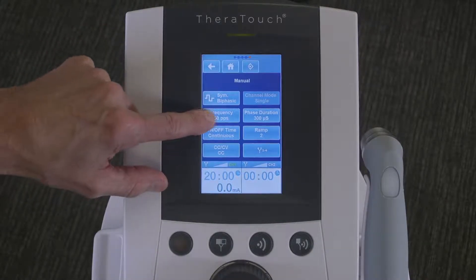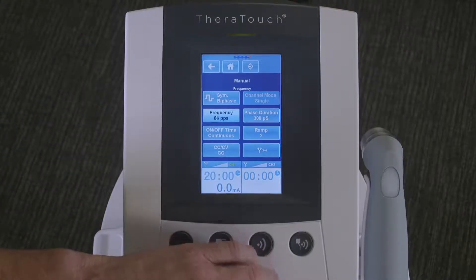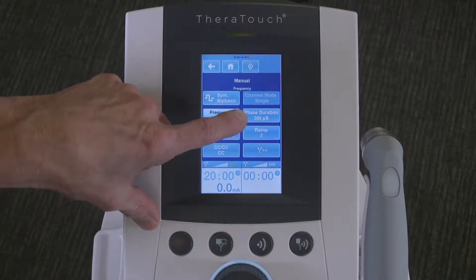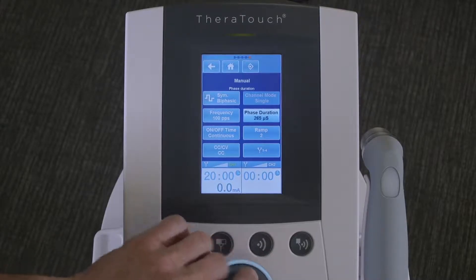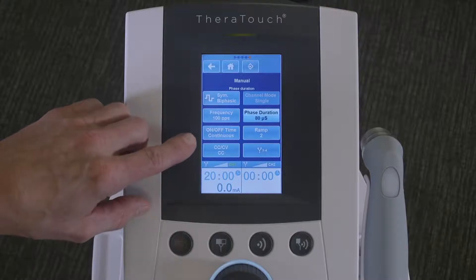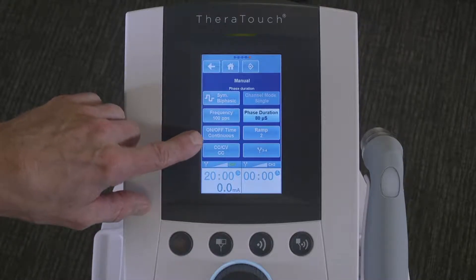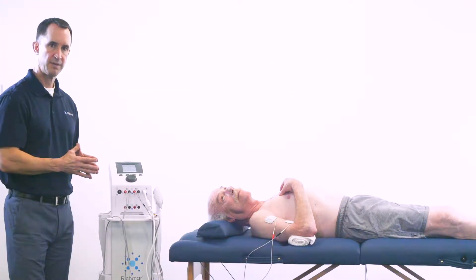We're going to adjust the frequency to 100 pulses per second. We're going to adjust the phase duration to 80 microseconds. And we're going to have an on-off time of continuous, which is what it's set at as a default. We already have the protocol pulled up on the screen.